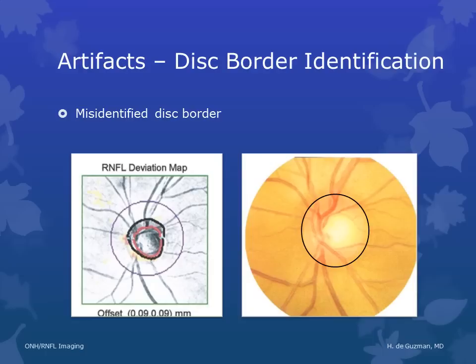One advantage of the spectral domain Cirrus OCT over the older time domain technology is that it does not require the technician to identify the disc border manually — it uses an algorithm. But sometimes that algorithm fails and you can have misidentification of the disc border. On the OCT RNFL deviation map, the black line represents where the machine thinks the disc border is. When you see a misidentified disc border, all parameters that depend on disc border identification — such as disc area and cup-to-disc ratios — are not reliable anymore. You have to make sure the disc border was identified correctly.